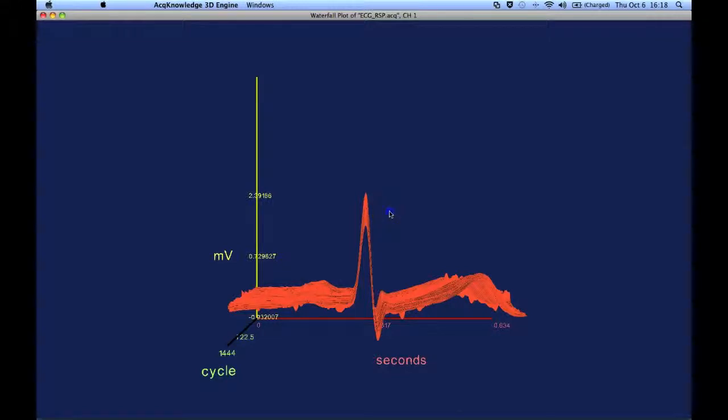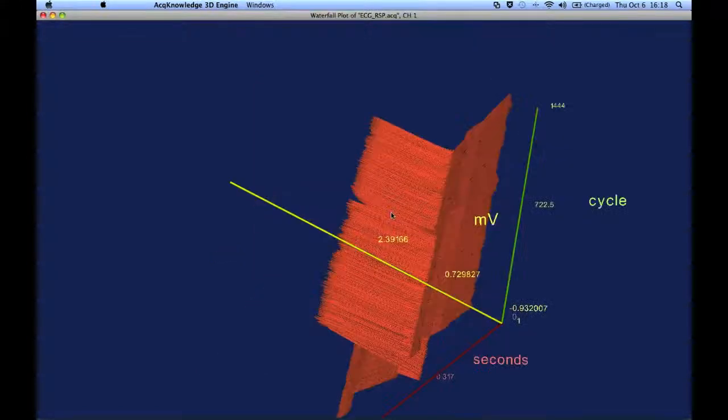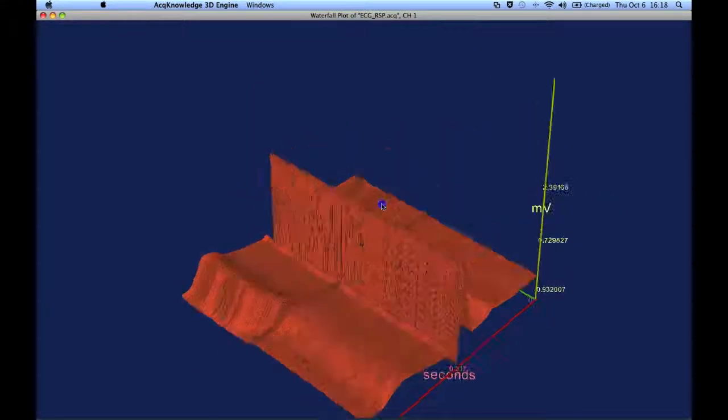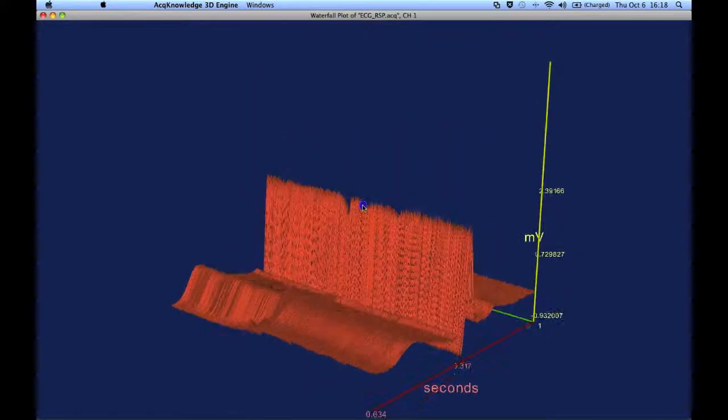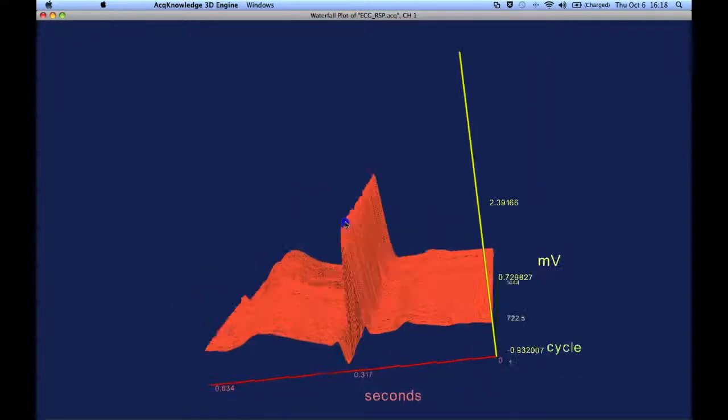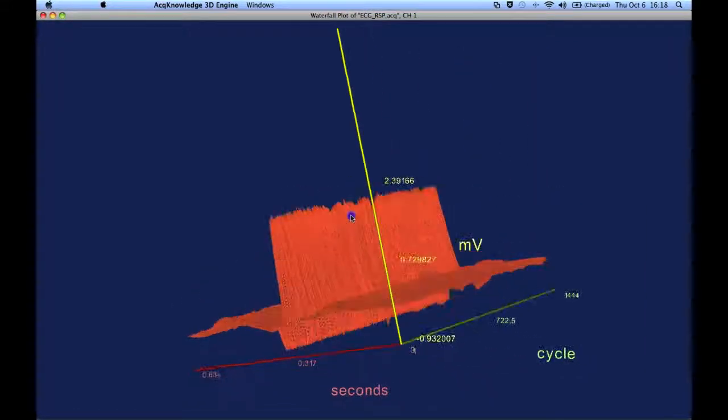And this can be rotated around, so that you get a better look of the data.